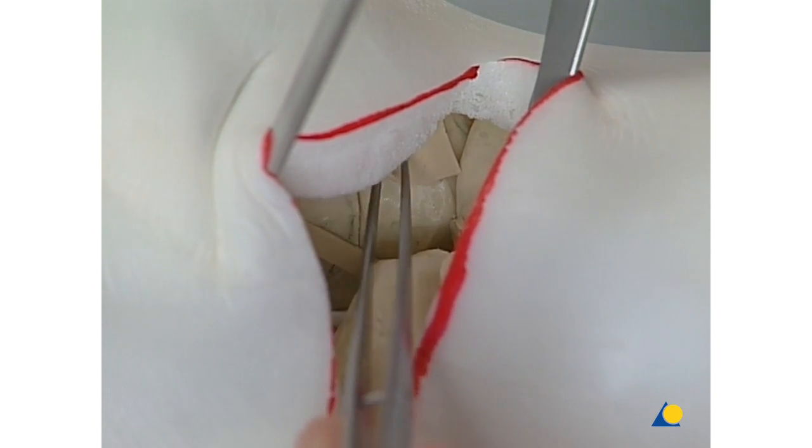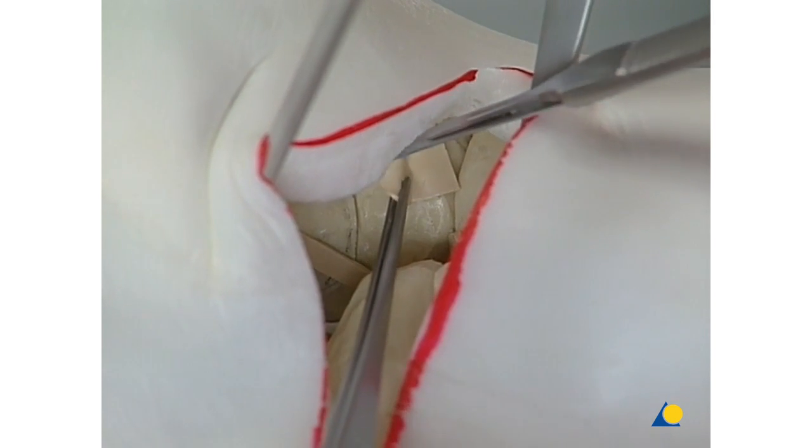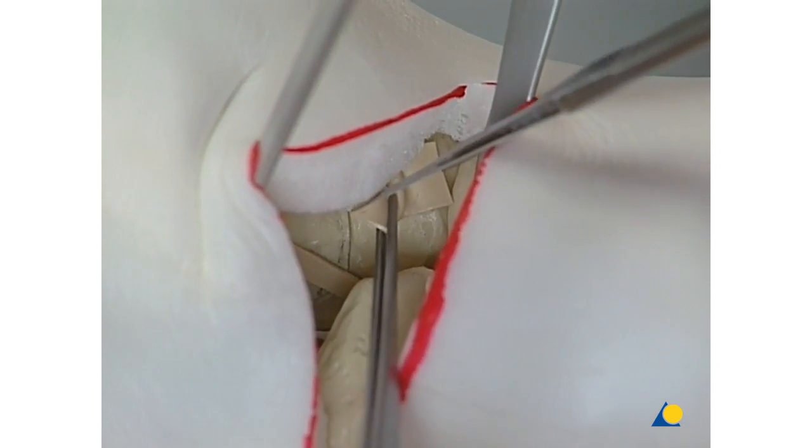For the same reasons as discussed previously for the medial approach, the rubber bands holding the fracture together must be removed.